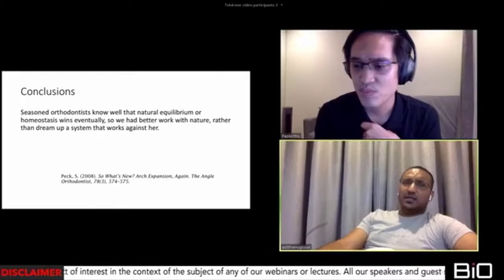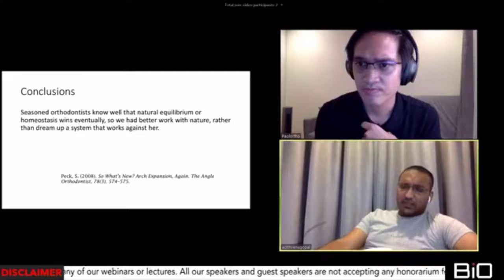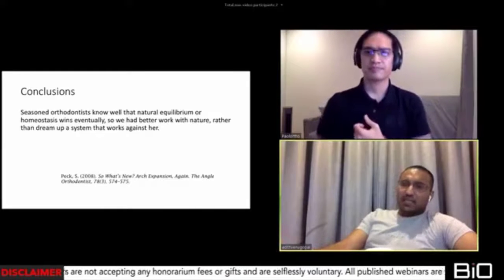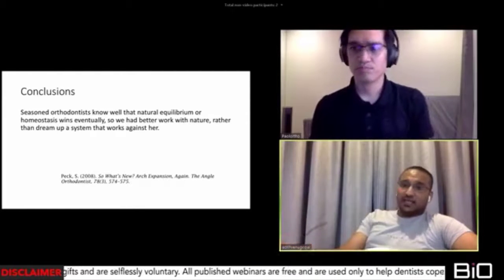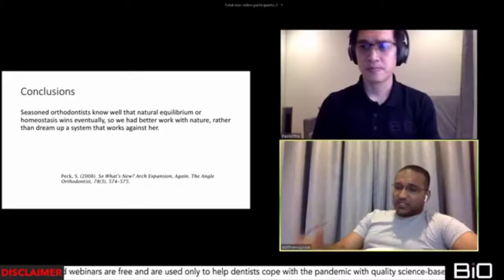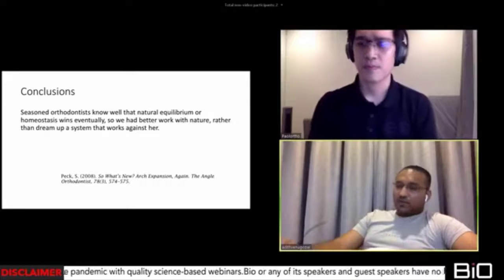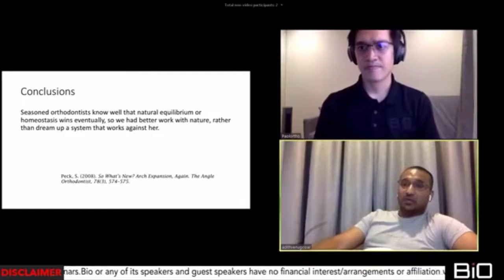I think it has a limited advantage. You need to use those heavy wires in order to get the absolute advantage. You can use a low torque on cases which involve proclination of incisors to maintain the incisal proclination, and you can use high torque where you need to retract and you don't want the incisors to dump. But I would use them very cautiously in extraction cases, especially. I would not use them on non-extraction cases without space, as there is a risk of exposure of root because of the increased and exaggerated torque values when it comes to high and low torque brackets.